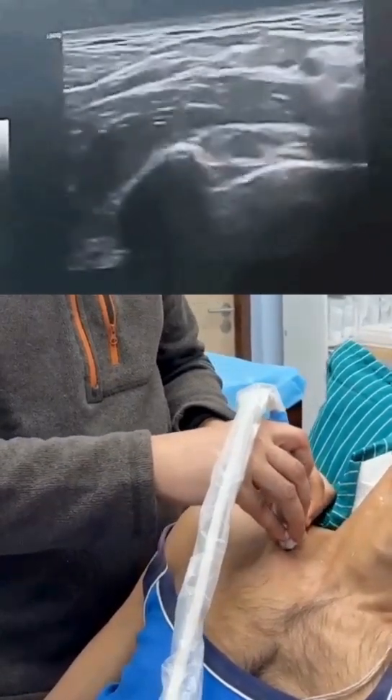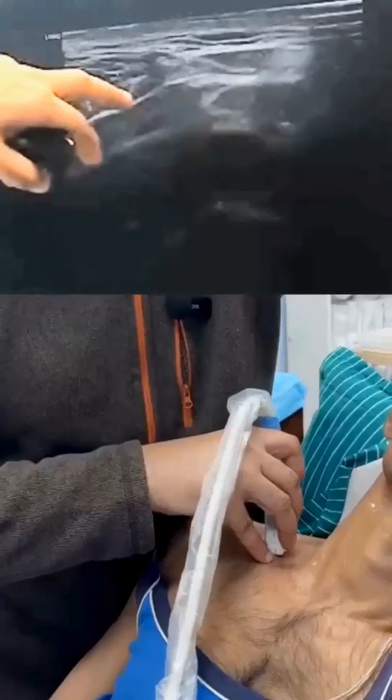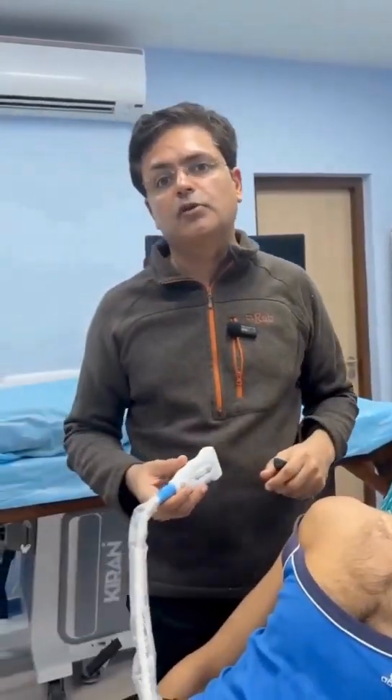This fast scan will help you appreciate the nerve more — it's right over here. Now be careful: sometimes there could be blood vessels in this area which will give you a similar appearance. So always apply the Doppler to check before you start targeting and injecting that nerve.